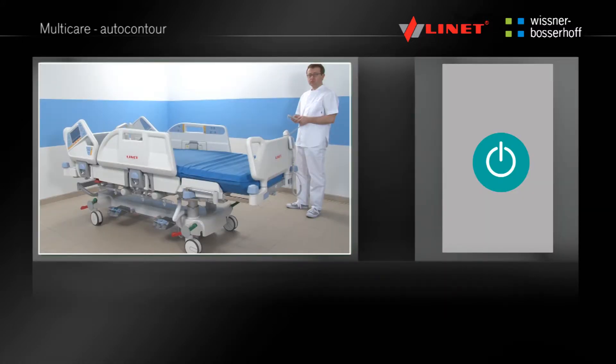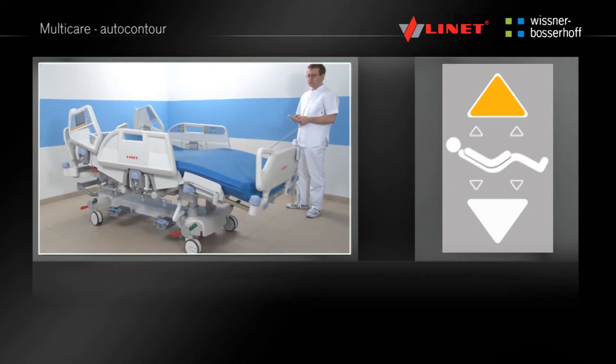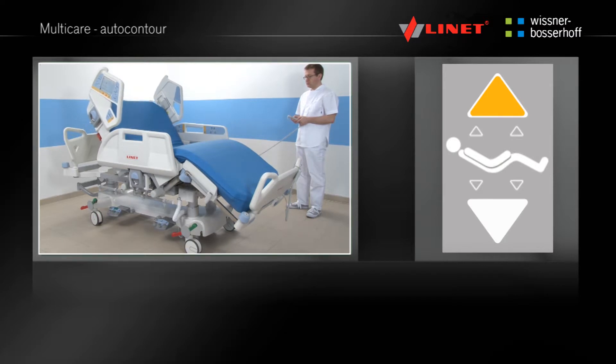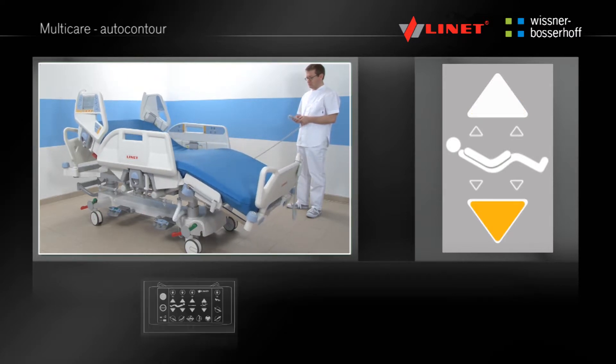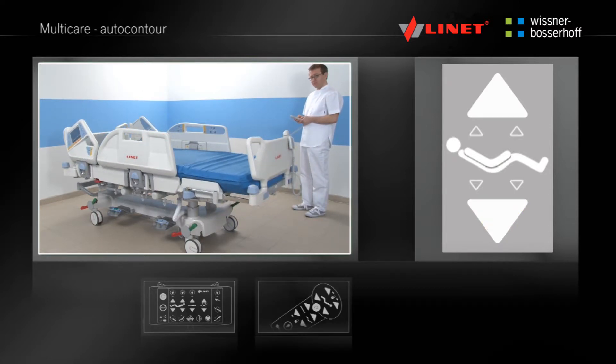Activate the function by pressing the Go button. Press and hold the function button until the desired position is reached. Auto-contour means the positioning of the thighrest and backrest simultaneously. This function is located on the Multiboard and the handset.